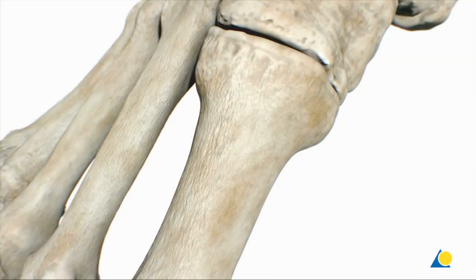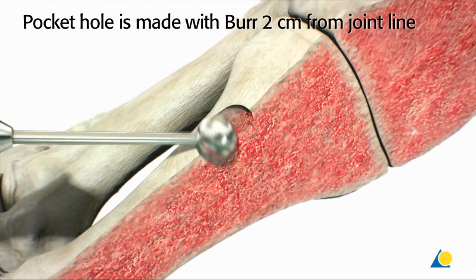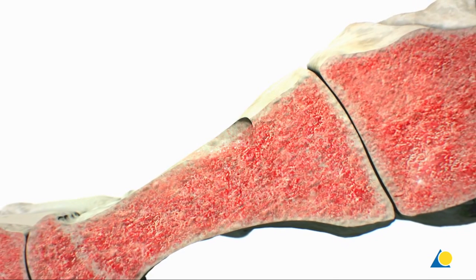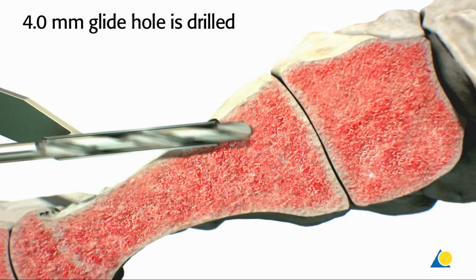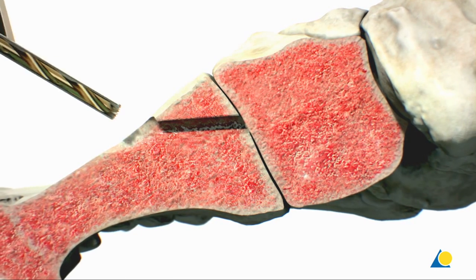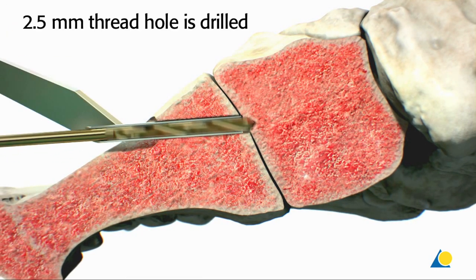The next step is to address the reduction of the first TMT joint. To provide increased leverage and prevent cortical break-off, the burr will be used to create a pocket hole for the head of the screw at a distance of 2 cm from the joint. It is important to note that the bone is very soft — not really hard cortical bone, but rather soft cancellous bone, more like a shell with a soft interior.